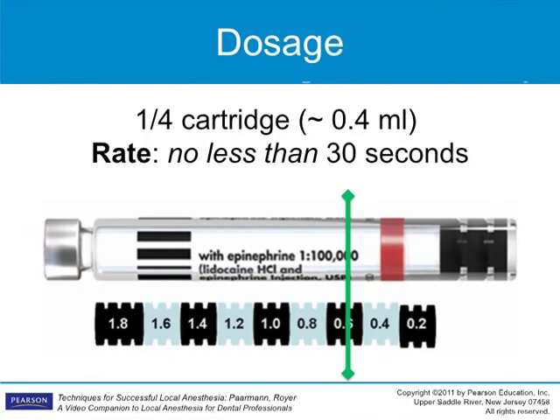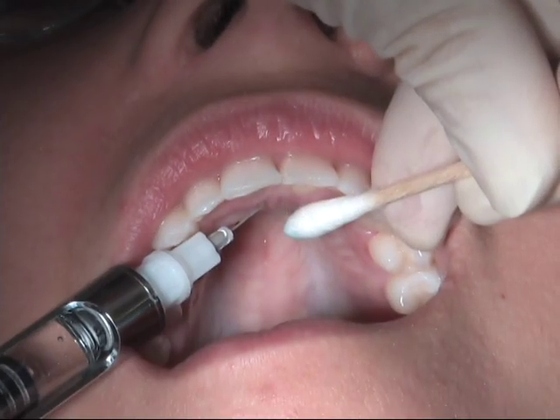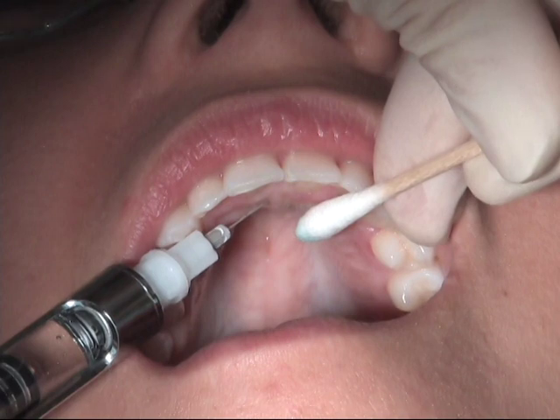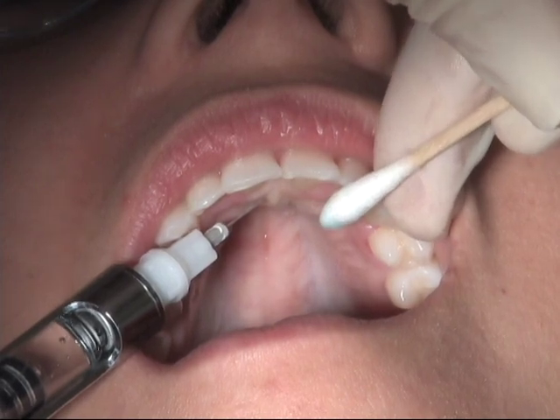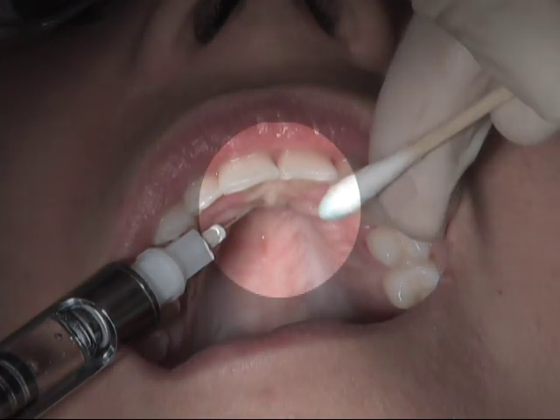Deposit approximately a fourth of a carpule. To avoid discomfort, the rate of deposition should be reduced. The dense tissues of the palate resist deposition and do not accommodate solution easily. In addition to increasing comfort, slow deposition will avoid unnecessary tissue trauma. The tissue should be blanched.